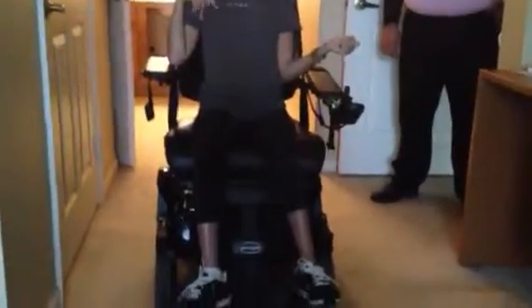Right now they're both unlocked, so they're in power mode. The chair weighs 400 pounds. I don't think I ever push this though, right? In a complete emergency, like for two minutes' time maybe — for whatever it takes you to get to where you have to go if something's not working. You're never going to push it though, but I just wanted to know.